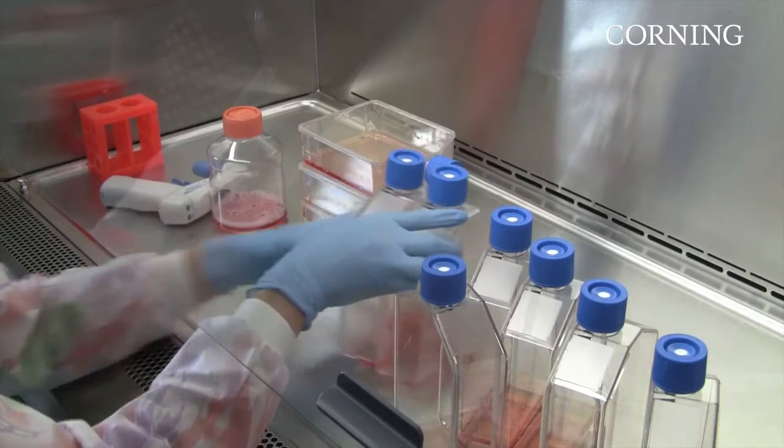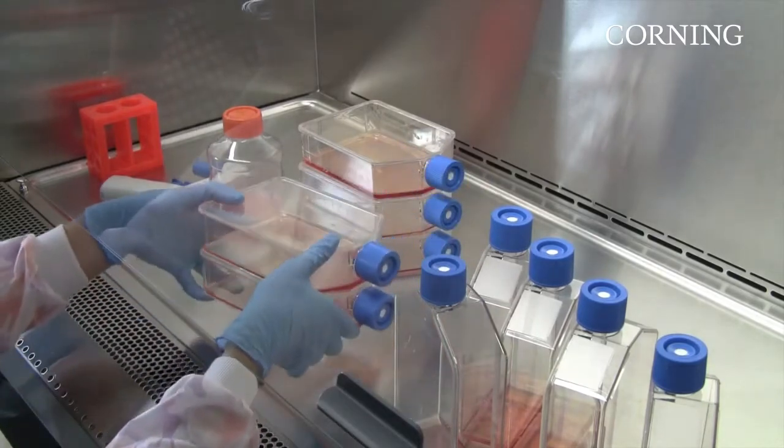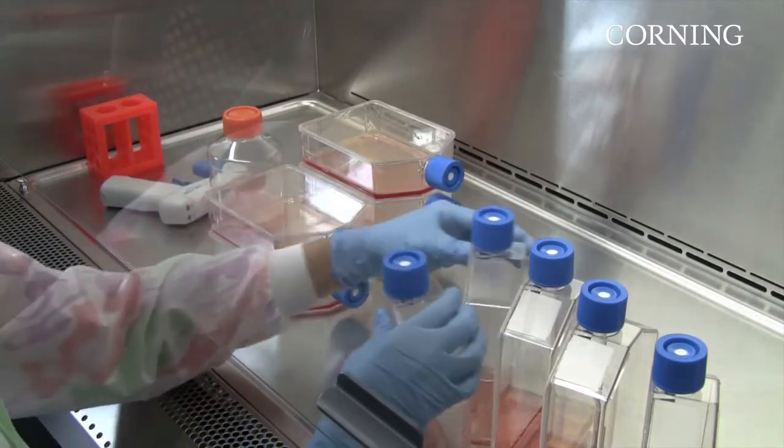These days, it's not unusual for labs to simultaneously prepare 10, 20, or more culture flasks at a time.